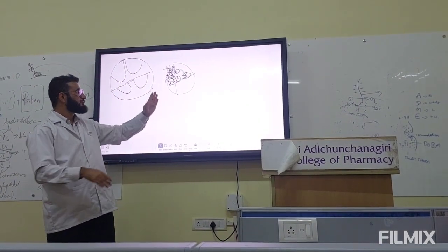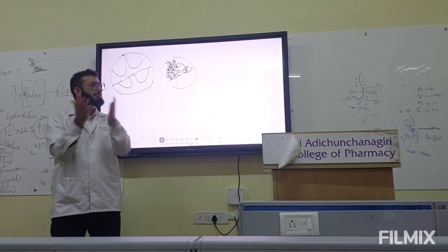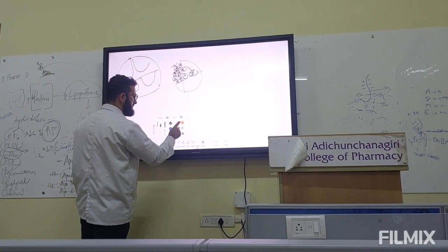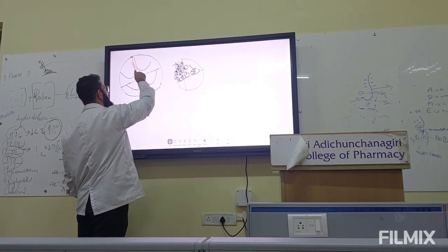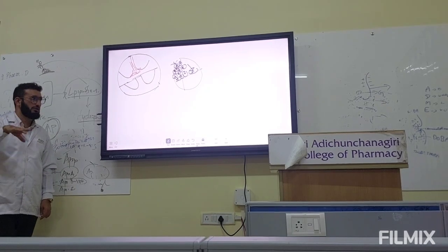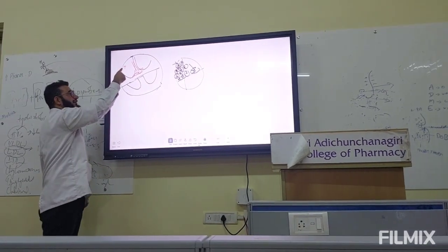We will take the summation of the vectors, and these vectors can be represented by a single vector moving downward, like this, carrying positive charge in its head towards the apex of the heart. So this is the first electrical event.